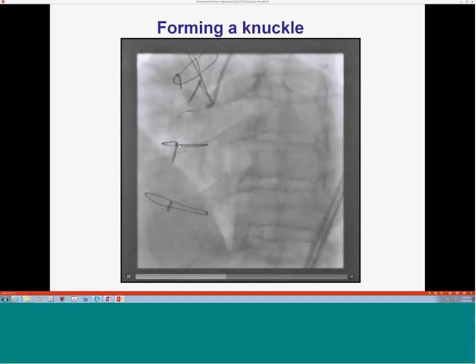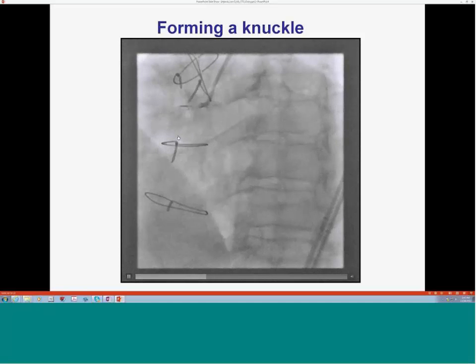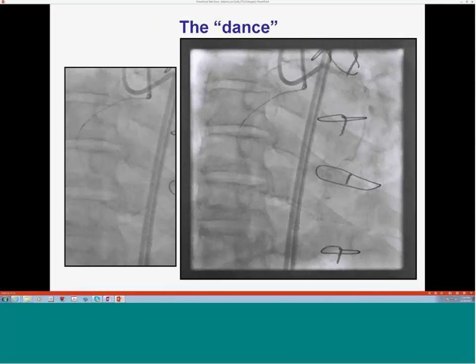So after it failed to go retrograde, the next step was we'll try Antegrade again. Again, CrossBoss didn't work the last time, so we tried with the knuckle. So this is the Corsair catheter together with the Fielder XT wire. And I must say, increasingly so, I'm using the XT for my knuckles mostly because the Pilot 200 is just too big. It makes a very large knuckle, and it makes it a little hard to do this. So I'm using XT more and more for my knuckles.